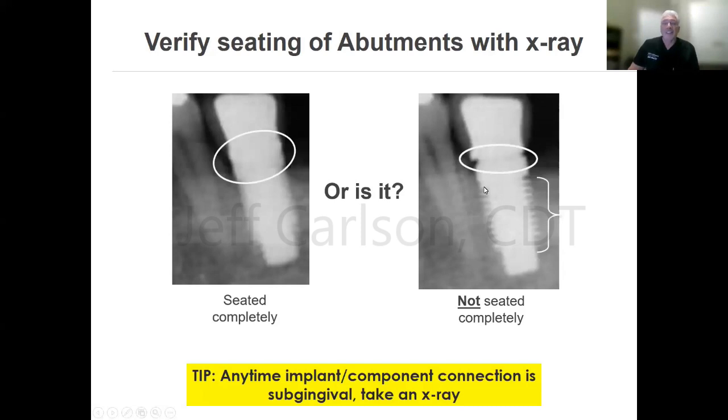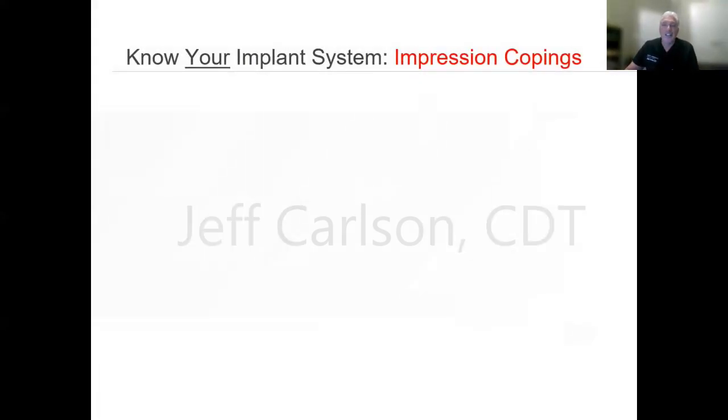And I was kind of excited because I'm going, nanner, boo-boo. Here you go. There's our threads. And look at that. There was a gap. So I just think that whenever your connection's below the gum line, where you can see it visually, it's not a bad idea just to do this. You've got the digital way of doing it now, so it's quick and easy to do.